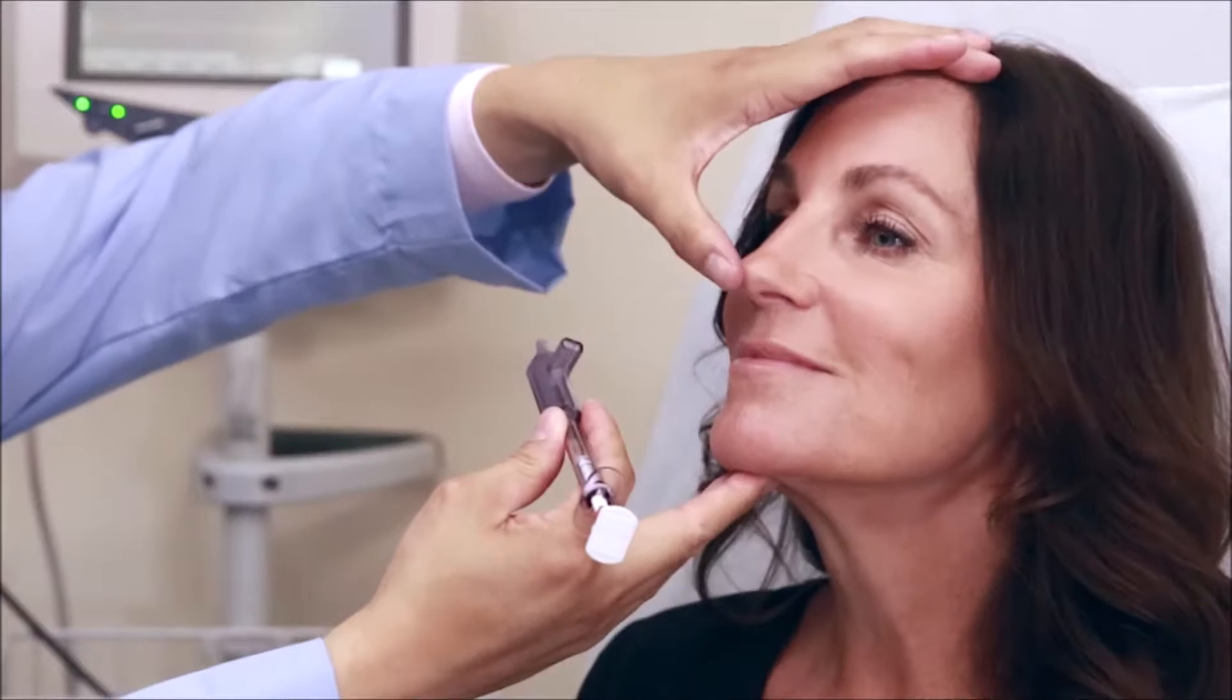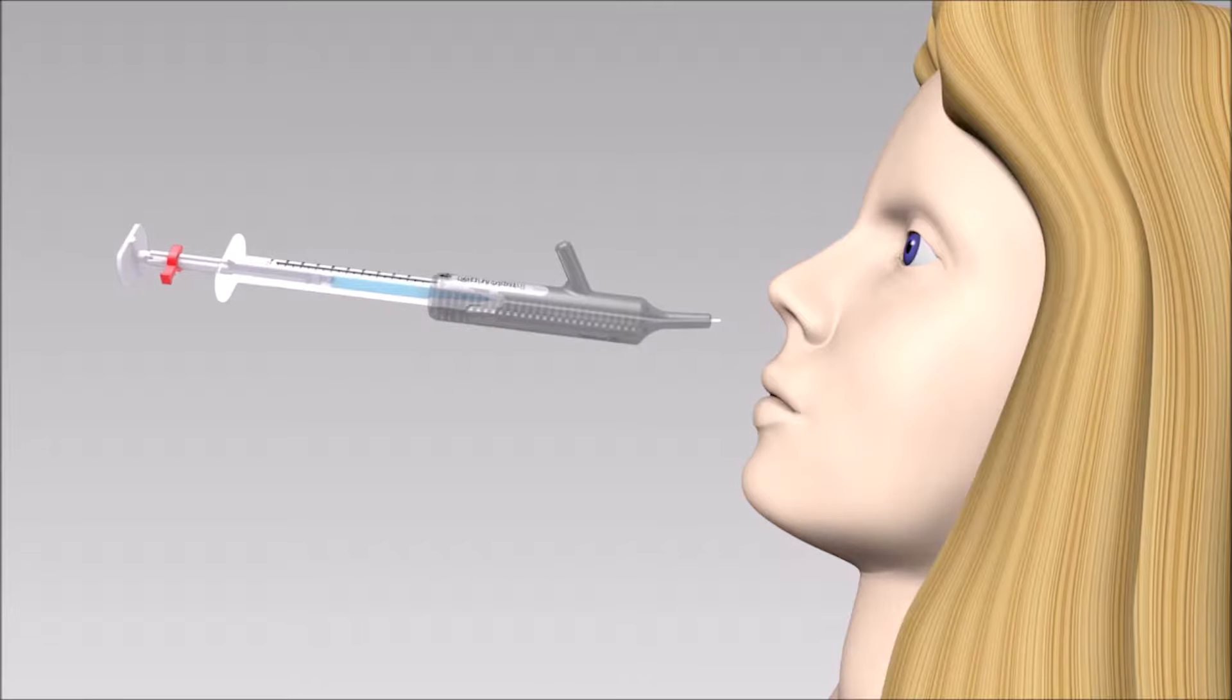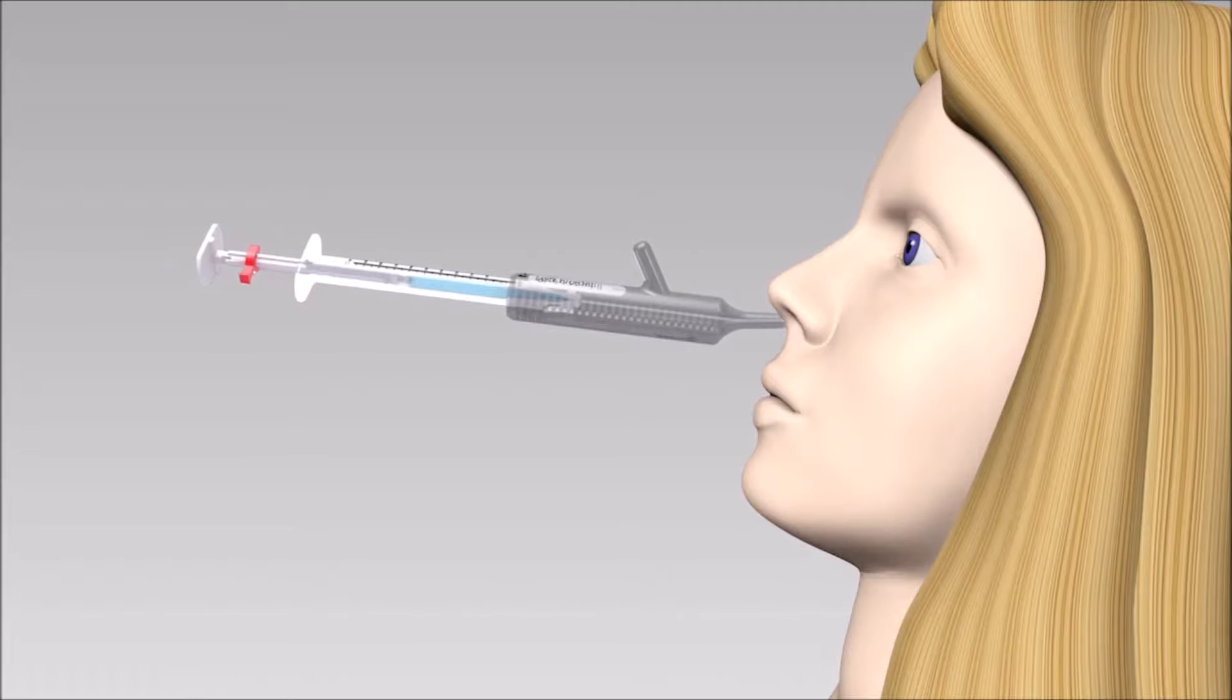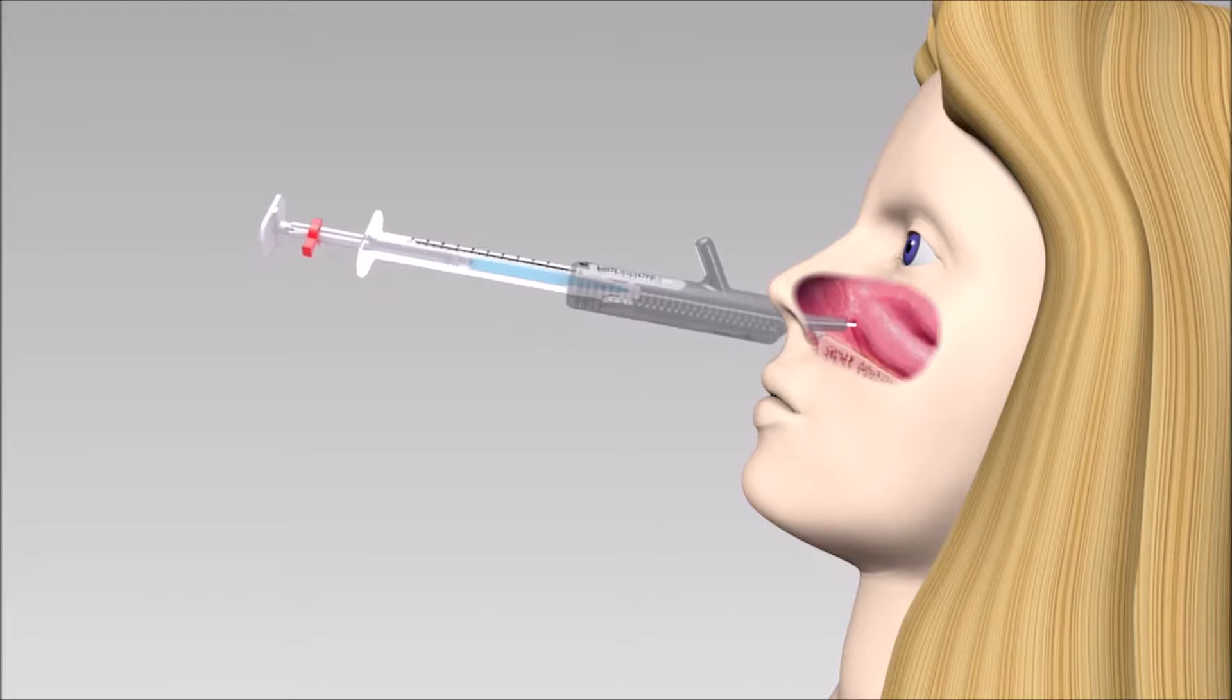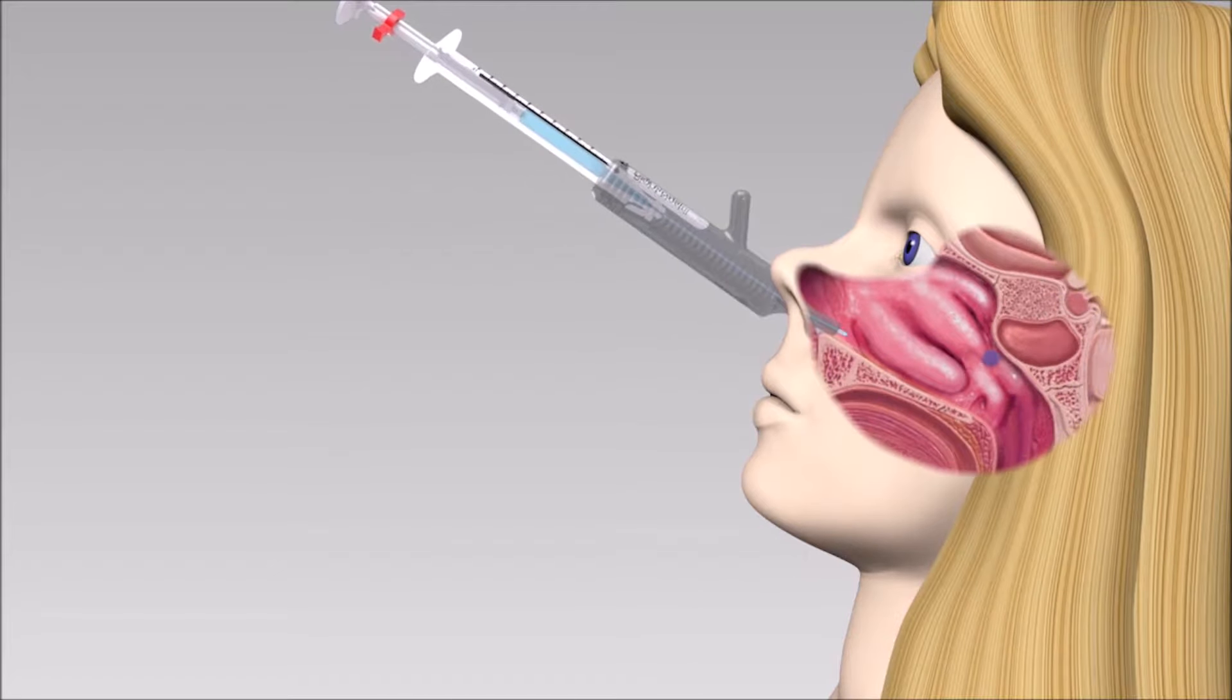Using your dominant hand, insert the short tip of the TX360 device into the nasal entrance of the patient as far as you can by pointing slightly superior and directing posteriorly as shown here.